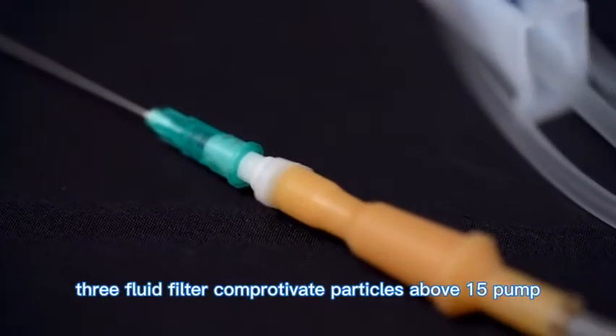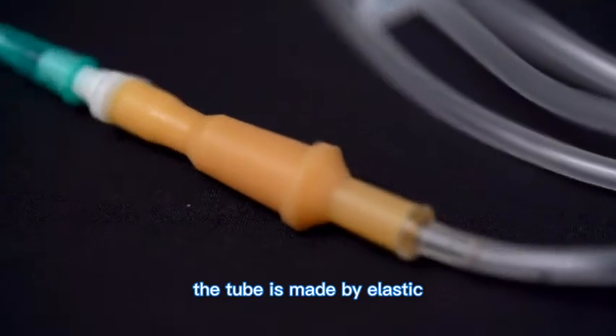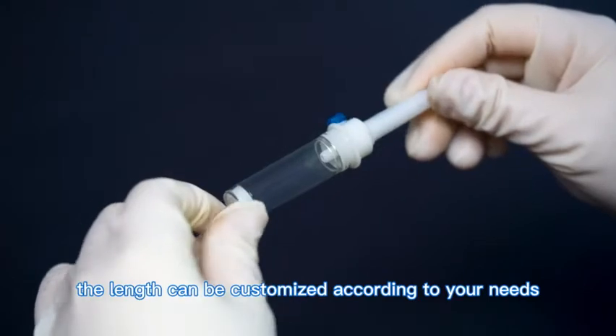3. The fluid filter can prohibit particles above 15 µm. The tube is made of elastic material, which can avoid bending and kinking. The length can be customized according to your needs.